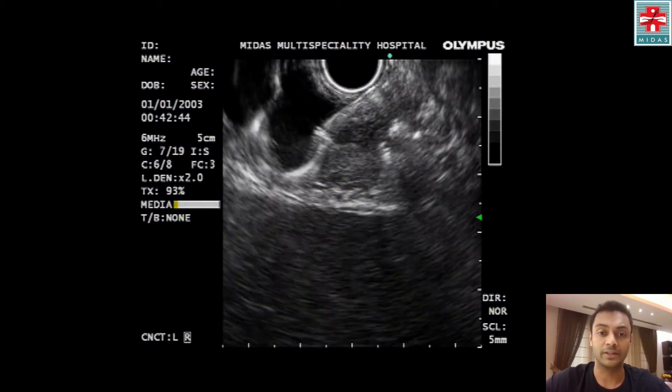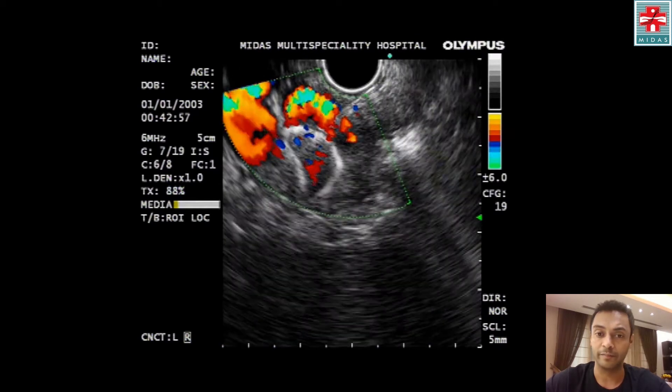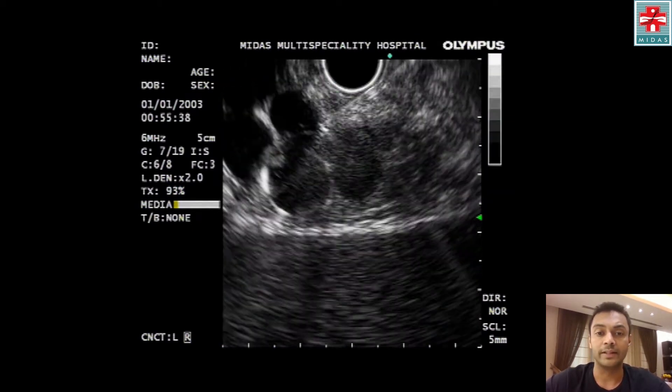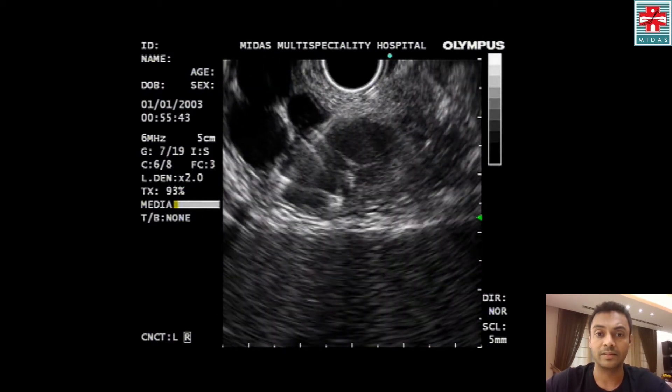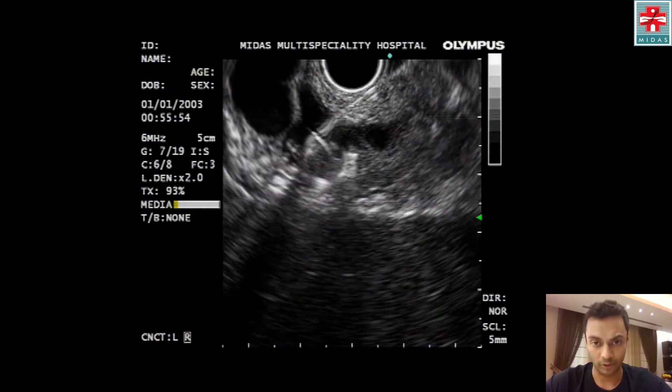This is followed by deployment of a coil — we use the MRI coils, 12 millimeter by Cook. Following this, we advance the needle again inside the fundal varices, followed by deployment of another coil.